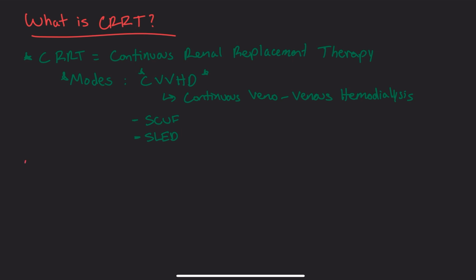The next thing we'll talk about is some of the indications for CRRT. As I mentioned earlier, one of the most common indications is hemodialysis patients who are too unstable to tolerate traditional HD.